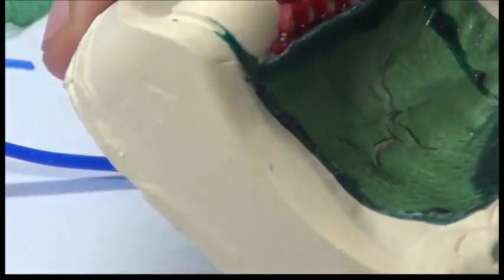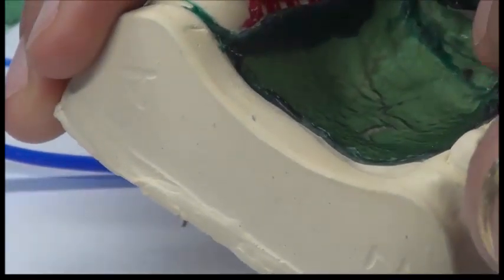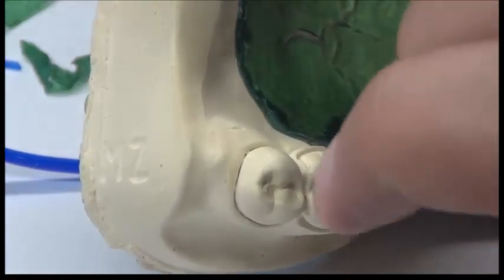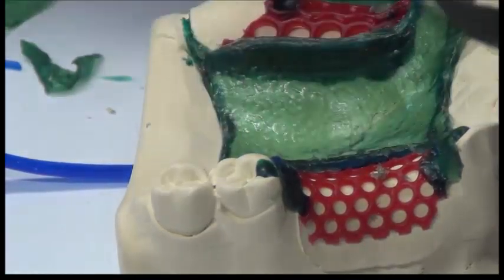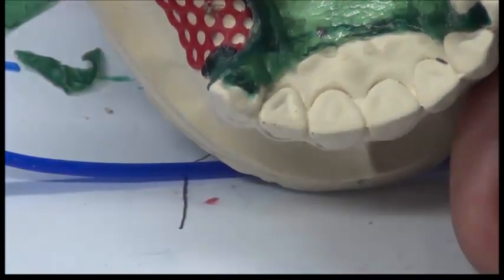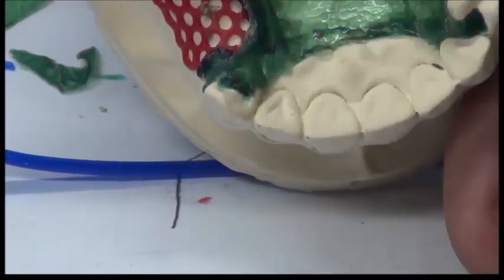Now over the canine, once more, we have the choice to make it as a plate. And this will be our cut. Or we can make them, okay? I have two choices on the canine. I could have a coverage by a plate. Okay, this is option number one. And notice that the major connector here over the canine area, it runs over the canine area and over the cingulum. That means if I'm looking at this from the internal side, I should see the cingulum in the major connector if I'm using a plate.